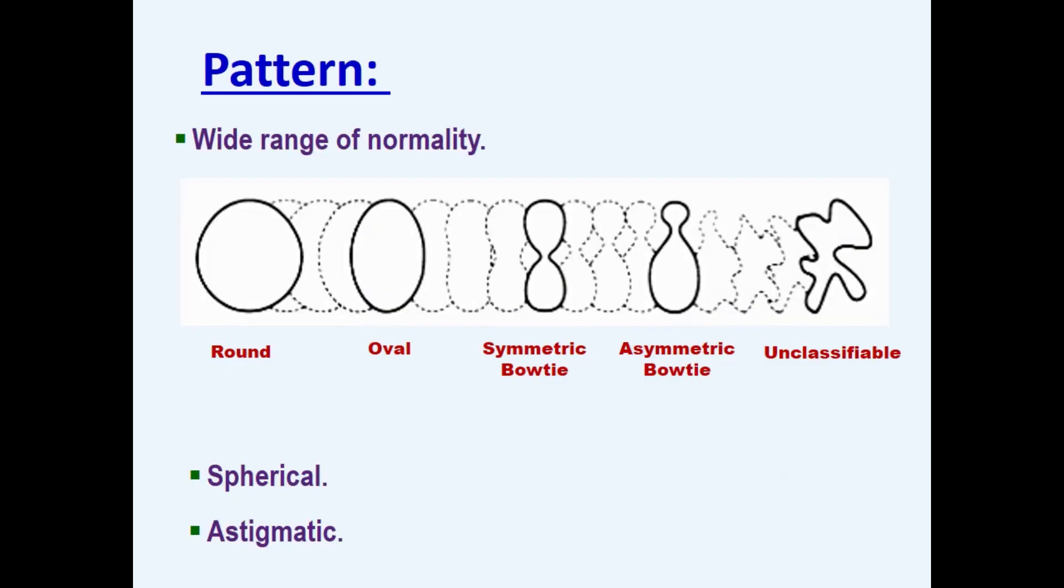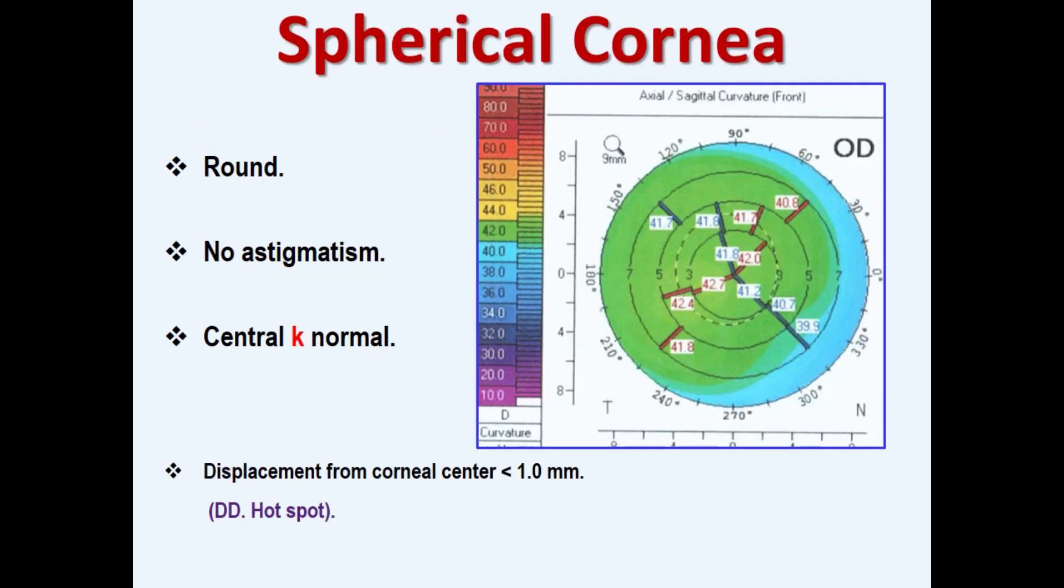Topographic pattern. One should keep in mind that there is a wide spectrum of normality of human corneas, and regular corneas are either spherical or astigmatic. Spherical cornea has a round pattern which indicates no significant astigmatism. This round pattern is located centrally and the amount of displacement of the corneal center is less than 1 mm.